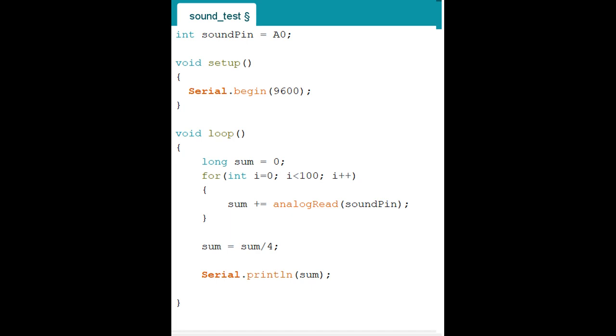There's no communication, right? So vice versa, if I assigned A1 as my pin, but I plugged my mic to different pin, then there's no communication, right? So that's like number one troubleshooting that you can do, is always a checking. Hey, is my software is assigned correctly, and I plug the things on the right position, right? So right now, I so far said, okay, I'm gonna input. There is an input at A0, and I'm gonna call sound pin, and that's integer, which is number.